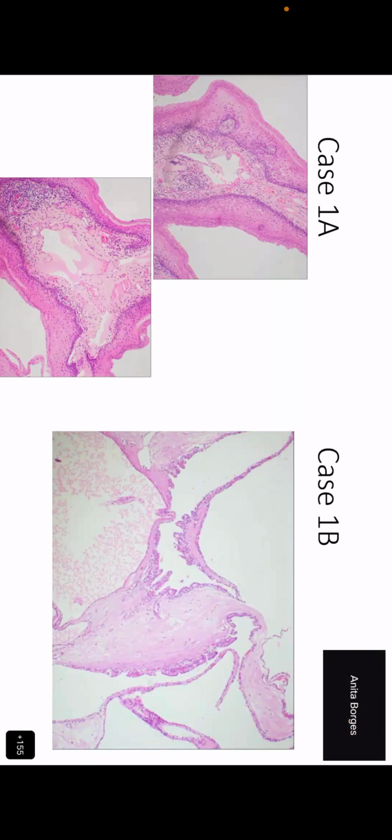What is the lining? In case 1A? Ma'am, it is having a discontinuous lining by the endothelial cells. Discontinuous lining by endothelial cells. Do you really think that endothelial cells are discontinuous? Cannot be, no? All right.